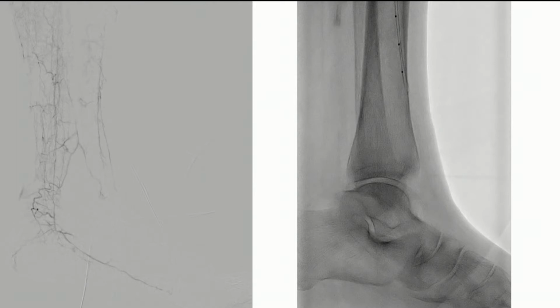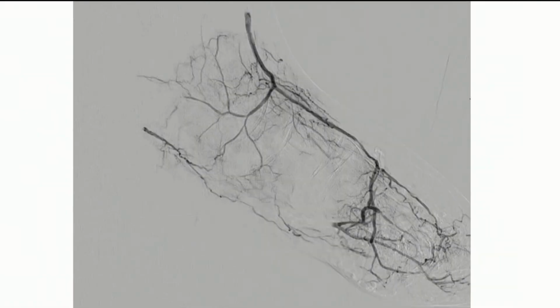And on the next image, you can see the kind of blood flow that we could potentially restore. And there you have it. So on that initial image and pictures, we saw no blood flow going down the top of the foot. And now you see this big, robust blood vessel going to the foot.